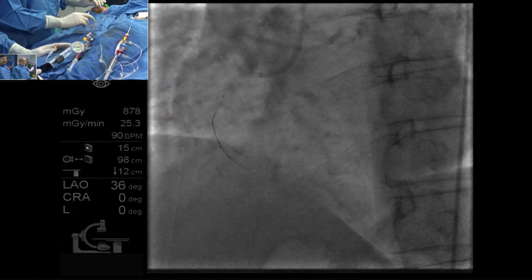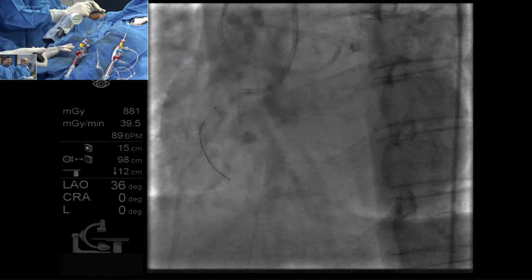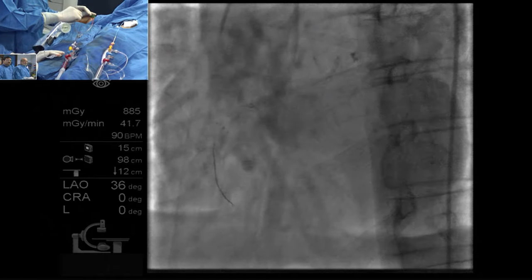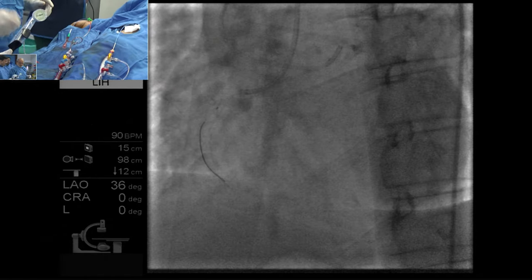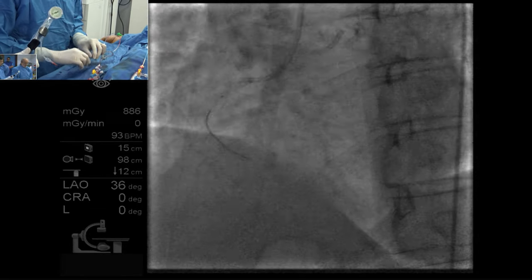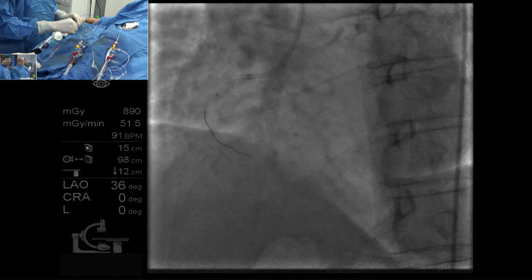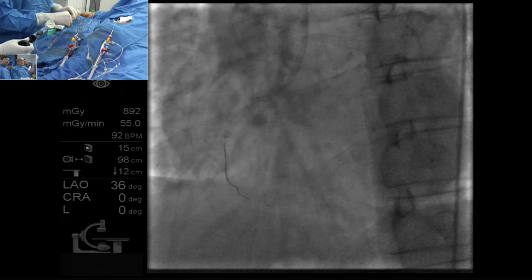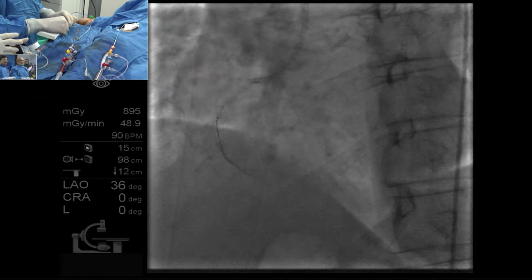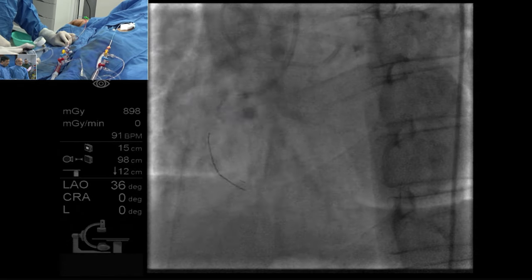I think with the advent of other technology, that's probably going to be the main indication for laser going forward. For unbreakable calcium lesions, lithotripsy is becoming increasingly important. For thrombectomy, I've never thought that laser was that useful. So I think this is probably the main indication for laser, certainly in our hands. I don't know how it is for you guys, Rajiv. I think you're right, Mamas. We're very eager to get some of that other technology you were mentioning, but I totally agree with your comments.